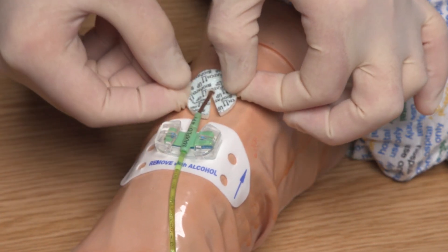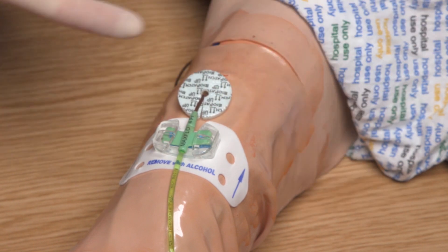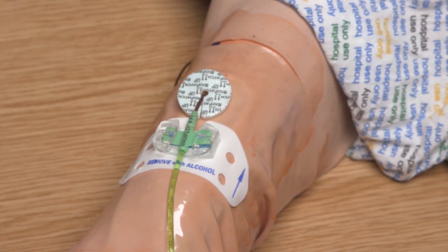I am now going to apply the chlorhexidine gluconate impregnated dressing over the insertion site. If it is a biopatch dressing that is being used, it is important that the side of the biopatch with writing on it should be facing upwards and the sponge side should be facing downwards onto the patient's skin. The slit in the biopatch should be positioned down towards the securing device and slightly offset from the direction of the catheter to ensure 360° coverage. This also ensures the biopatch removes easily when the dressing is next changed.